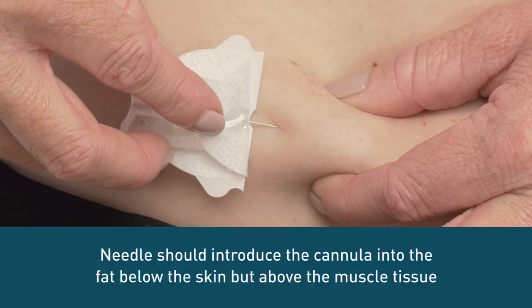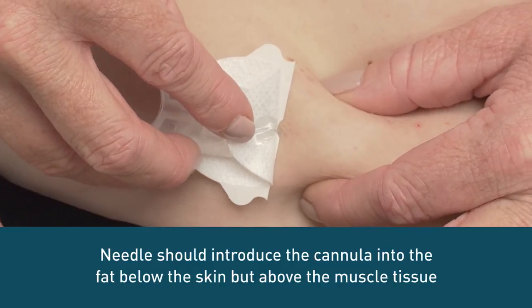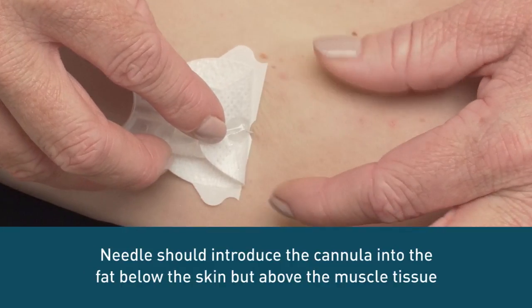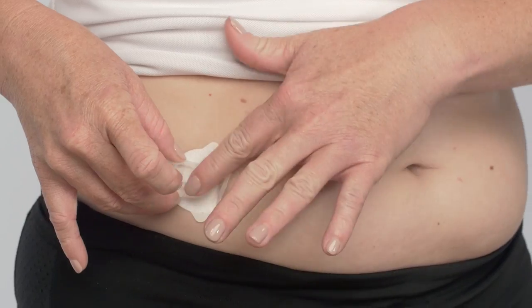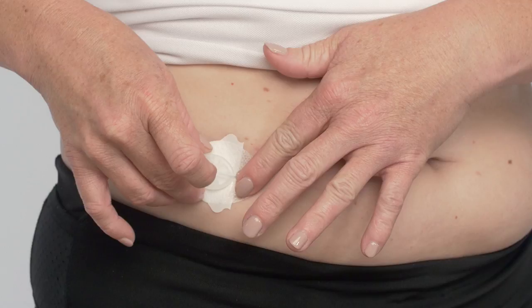Now you can insert the cannula. Release the pinch, leaving the cannula in the layer of fat just below the skin surface. With the cannula inserted, secure the front piece of adhesive to your skin by pressing down on the adhesive tape.